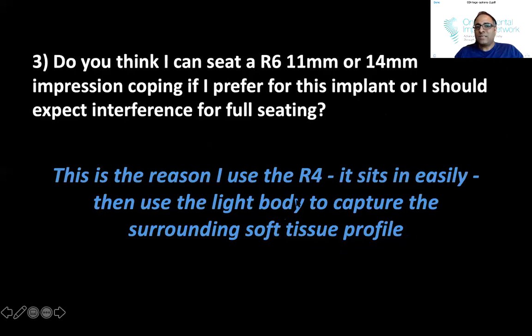So he asked, with a 6 mm wide healing abutment, can he seat an R6? Because the HYOSIN system comes with matching impression copings. And I said, you could, but the problem is if you have a whiny patient or it's pinching the tissue, then it becomes difficult really just to see. So I always advise just using the smallest one and using the impression material. Sometimes we'll even use flowable to capture the soft tissue.